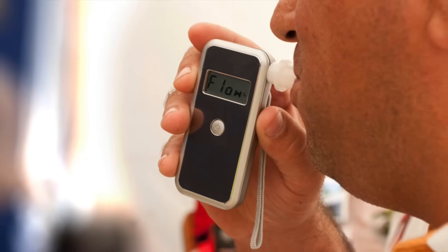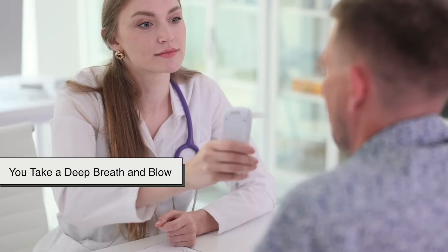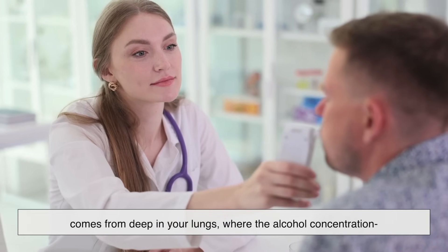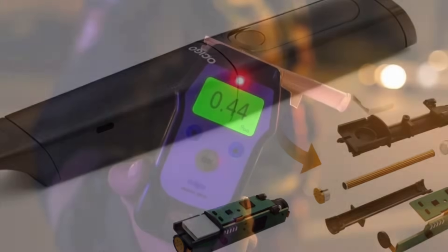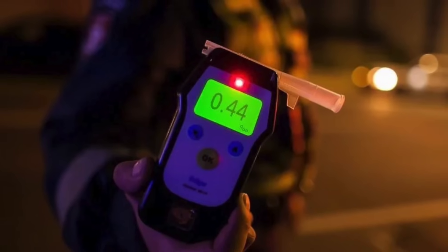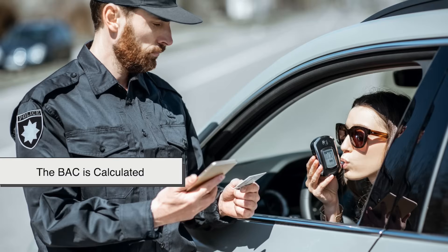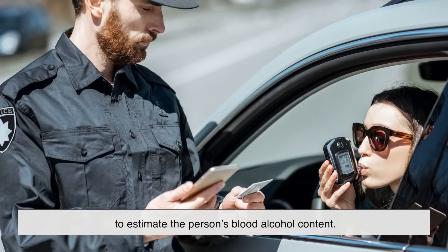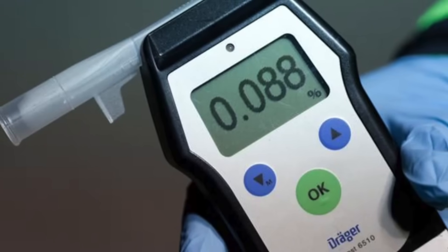Here's what actually happens when you blow into a breathalyzer, step by step. First, you take a deep breath and exhale a steady stream of air into the device. You must blow hard to ensure the sample comes from deep in your lungs, where alcohol concentration is most reflective of your blood alcohol level. The sensor then analyzes the alcohol using either a chemical reaction or infrared light absorption. Finally, the device applies the 1-to-2100 breath-to-blood alcohol ratio to estimate your BAC — if it's above 0.08%, the person is legally impaired in many countries.